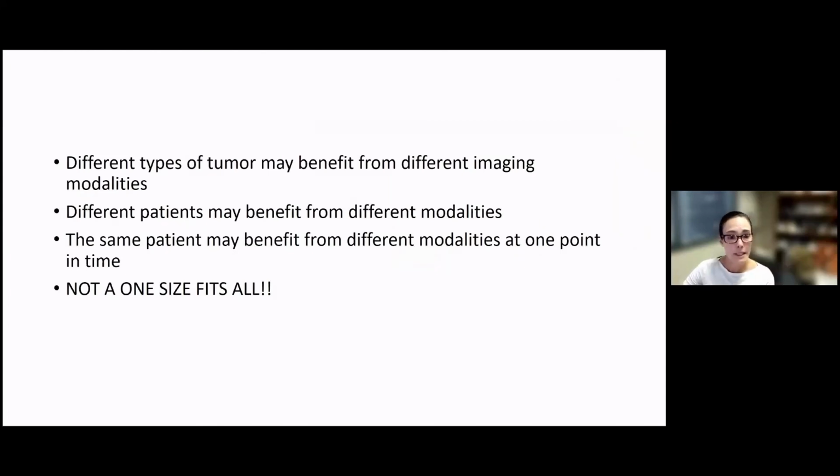So just some take-home points. Different types of tumor may benefit from different imaging modalities. So it all depends on what type of tumor you have. And also different patients may benefit from different modalities. It all depends on our body habitus and how the tumor is presenting. Even the same patient at different points in time may benefit from different modalities of imaging of the tumor.